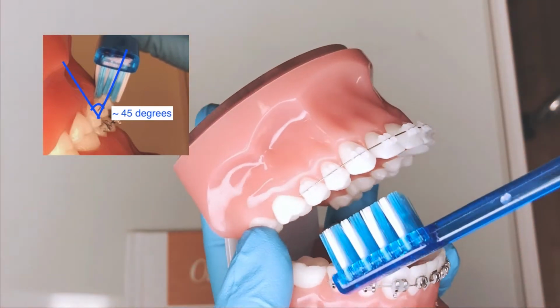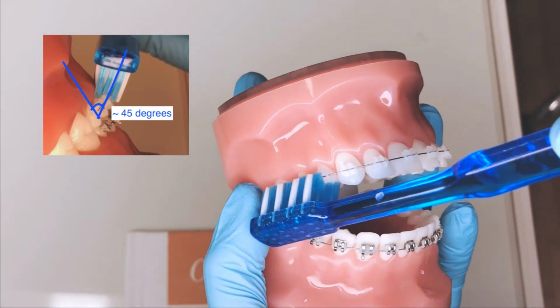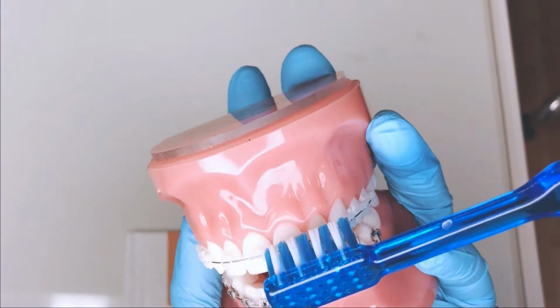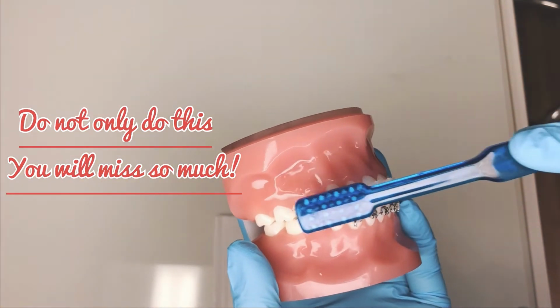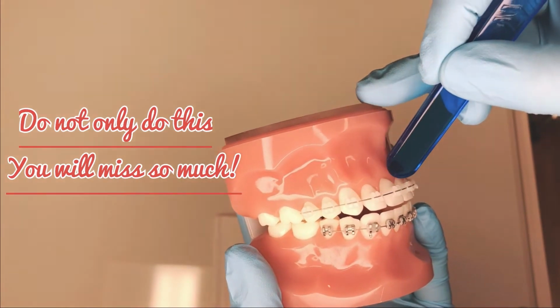Then, you want to change the angle so the brush head is now between your braces and the bottom part of your teeth. Again, moving it in a circular motion. Please avoid brushing only horizontally across your teeth, as this will cause you to miss much of what you should brush away along the gum line.